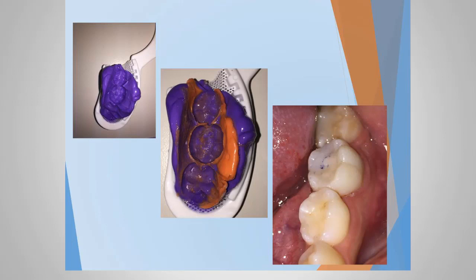So I like using this technique just simply to cut down on the amount of shaping, the amount of adjustments I have to make in the temporary that's going to be made from this.